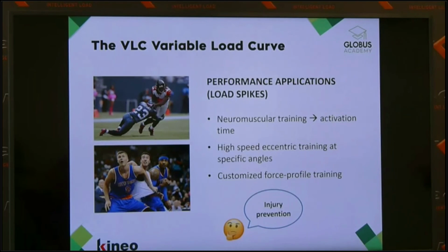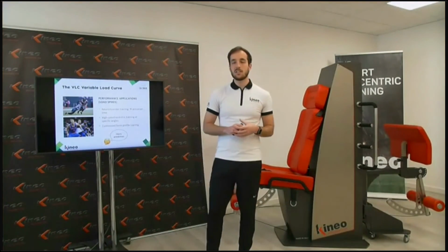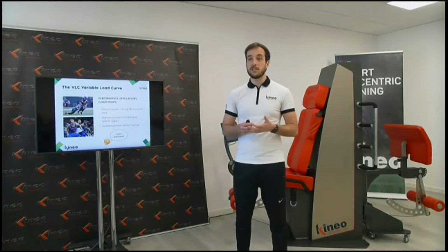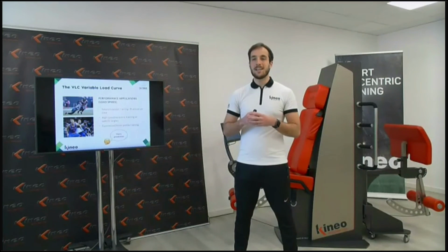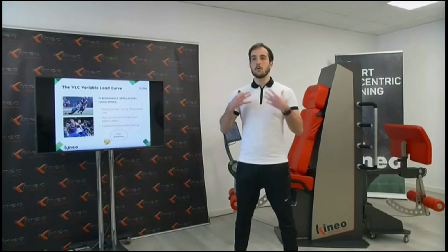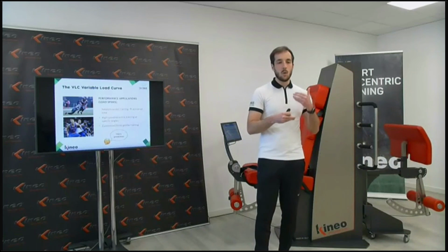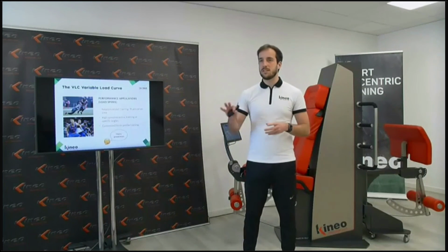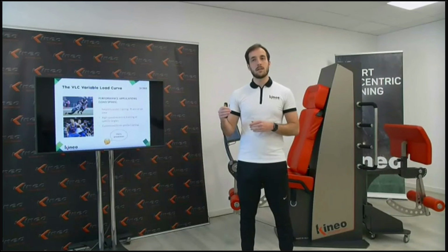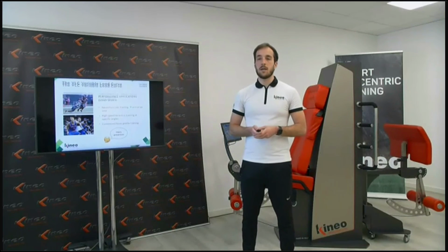And of course, this was one of my ways of making me ask a question like, isn't this neuromuscular training and isn't this injury prevention? So having something to react to, working on stability, working with variable loading, and definitely not using only one fixed load. The human body works in a very variable way, and so we must switch our mentality into using more variability in our loading. Of course, taking care of the basics, taking care of the athlete having strength before moving to power, and so on. All right, we are running out of time, unfortunately.